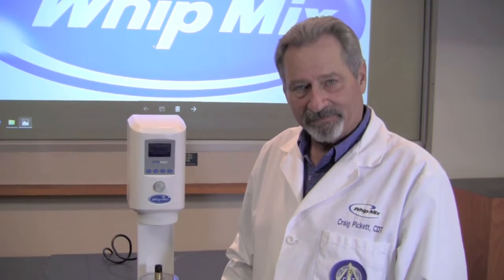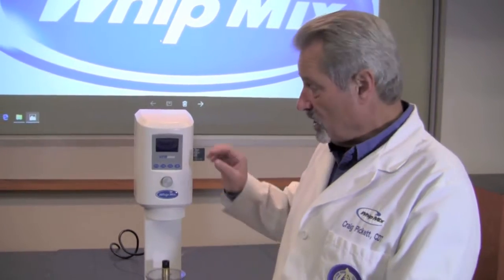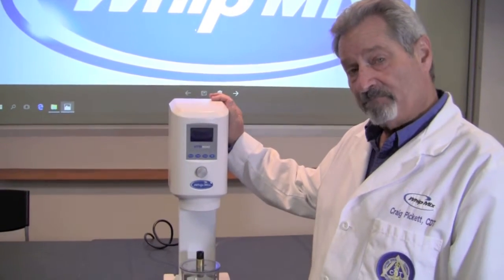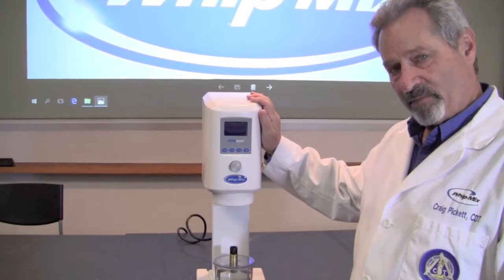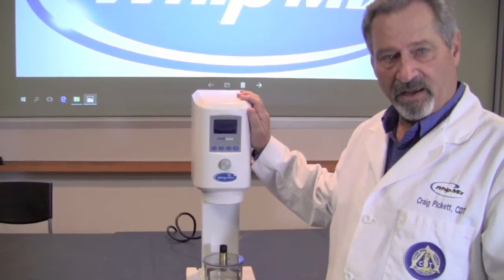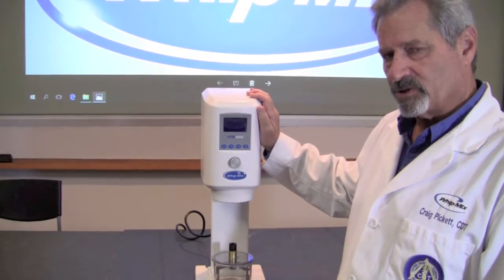Hello, my name is Craig Pickett and I'm the Technical Education Manager here at the Whip Mix Corporation. Today we want to talk to you a little bit about the new VPM Mini Mixer. We're going to talk about programming, maintenance, and a little bit of troubleshooting for this particular machine.